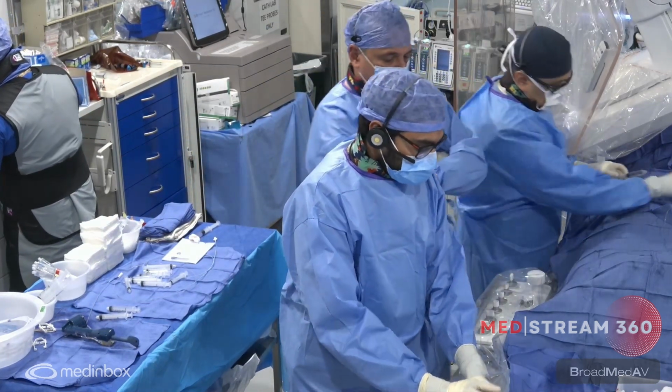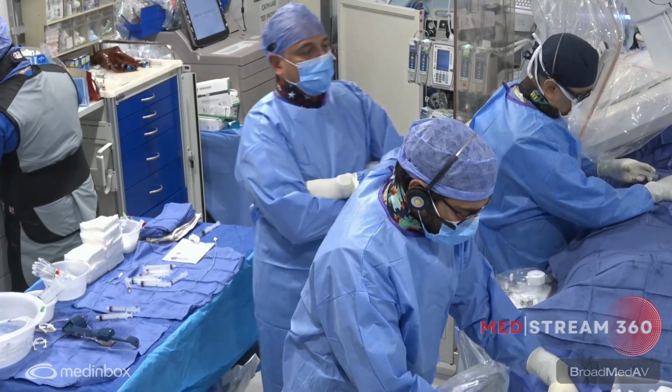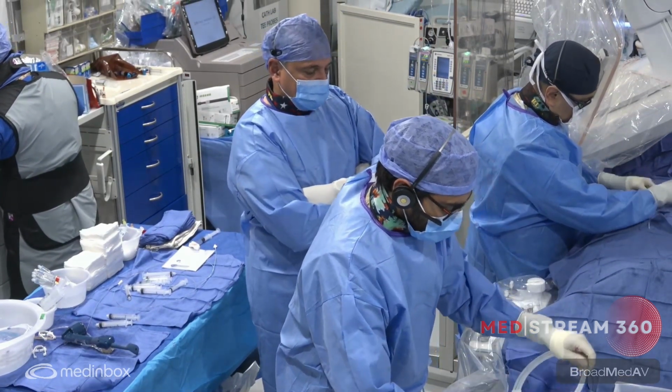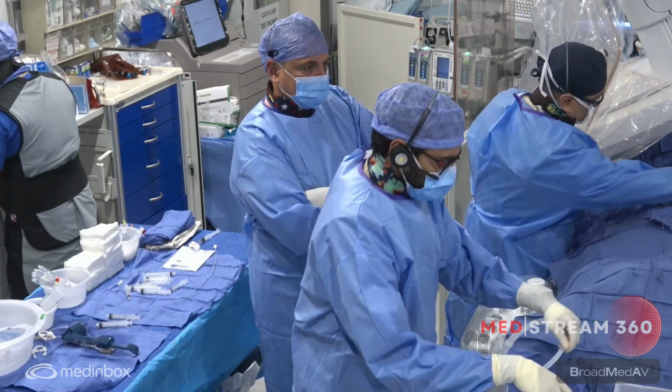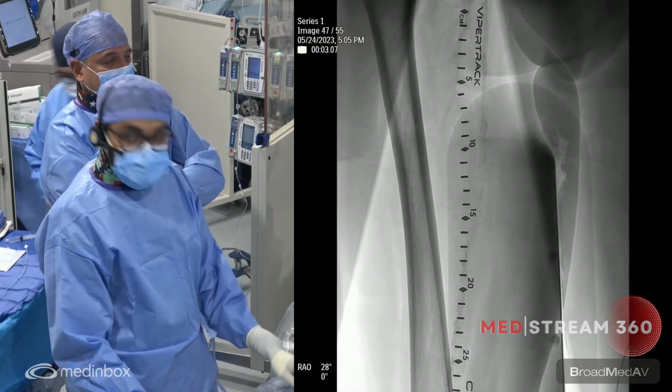So we brought her in, and as you know, that being intravascular lithotripsy day, we were hoping to get a really calcified lesion, and I'm gonna have Ibrahim just go over the quick angiogram here. Can you guys go to the angiogram for us? Okay, and you can see here.